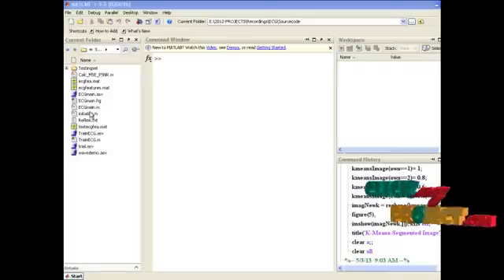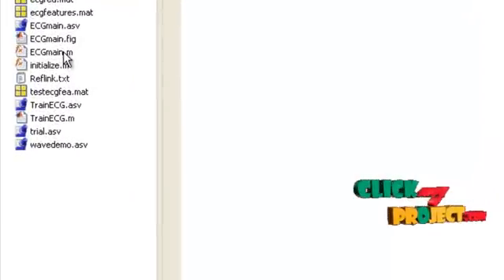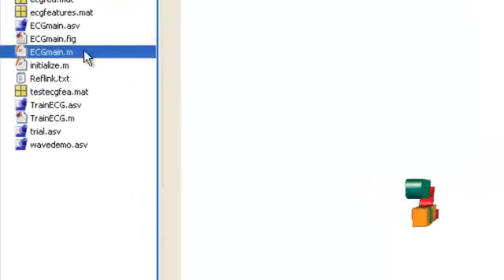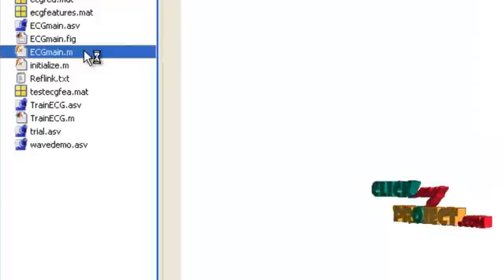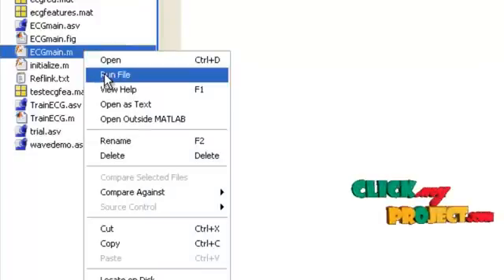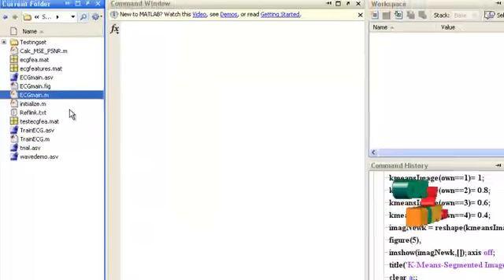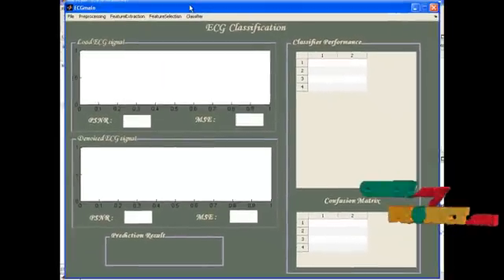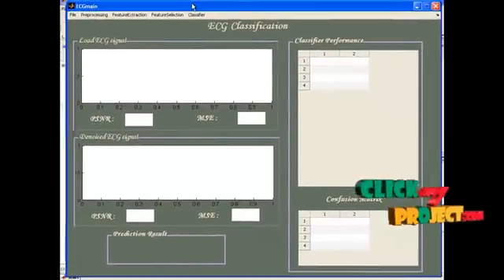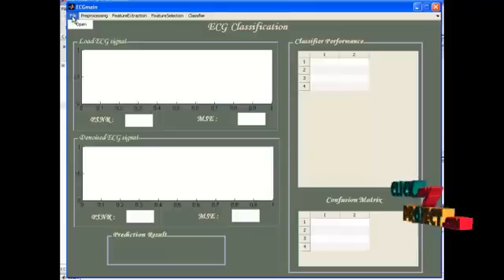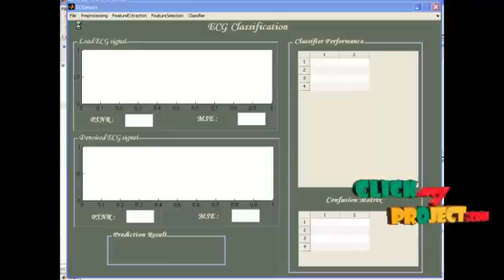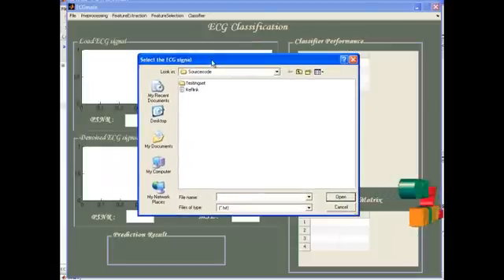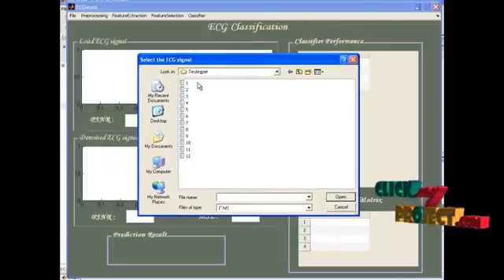Now, let's see the execution of our proposed system. The main file is ECG main.m. Select this file and then choose the option run file. A guide window will be shown to you with menu bar options. Under the file option, select open.